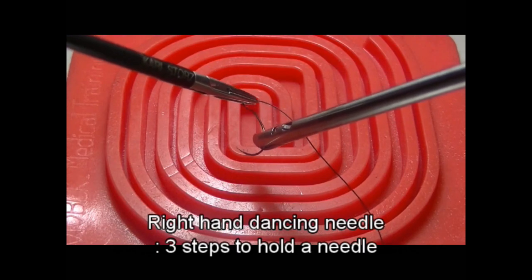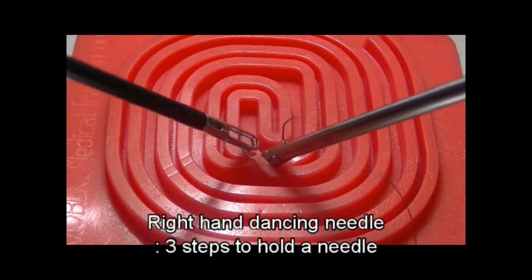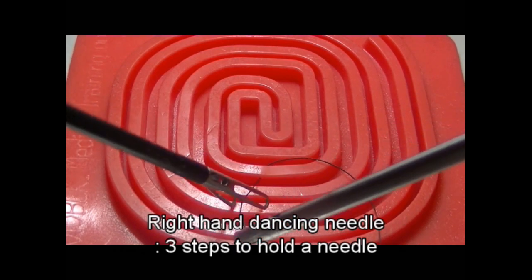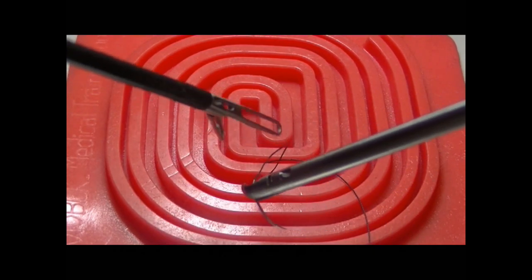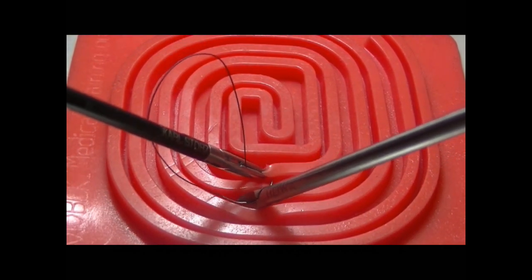This is the right hand dancing needle. I think this technique is more difficult than the previous one, but you can handle the needle quickly with this technique. I think the knack of this technique is grasping a needle gently, not too strong but not too weak. Some practice is needed.